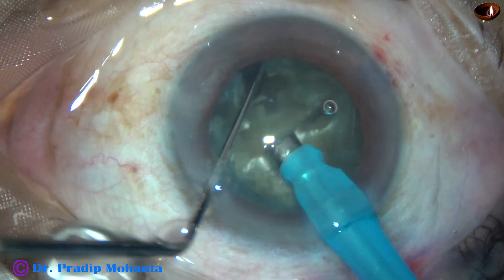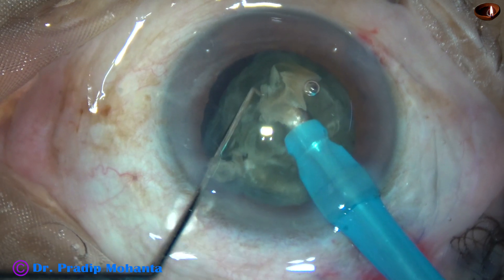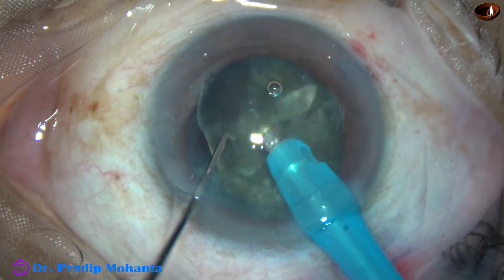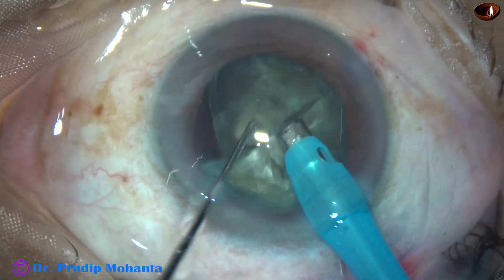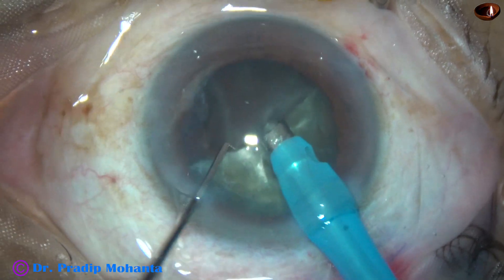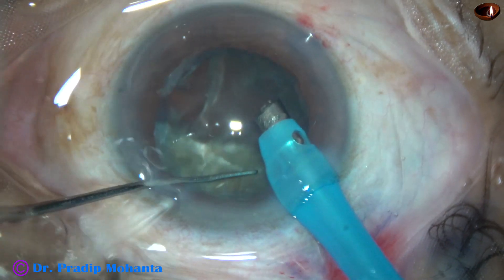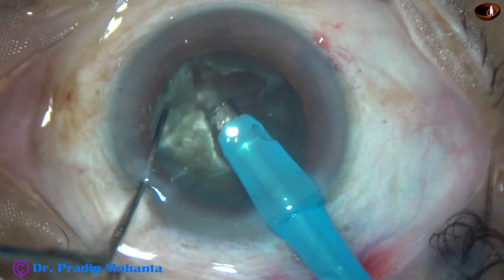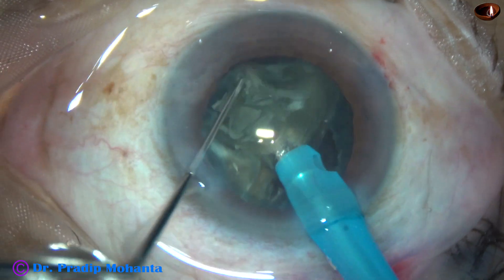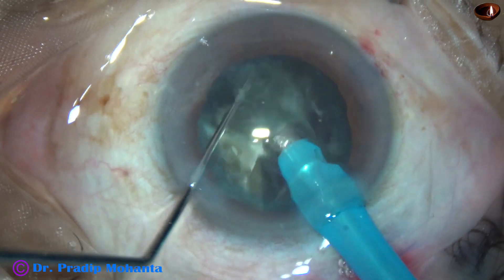So the nucleus has been divided into four fragments. Each fragment is now tilted and the nucleus of each fragment is removed, while the epinuclear shell is left. I am doing this to protect the posterior capsule. This epinuclear shell will act as a barrier to protect the posterior capsule.